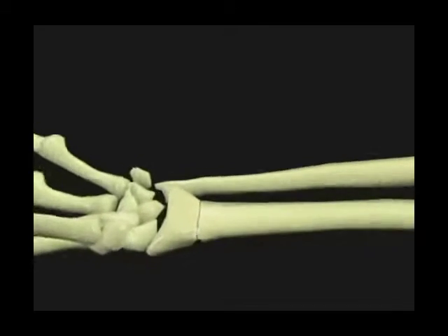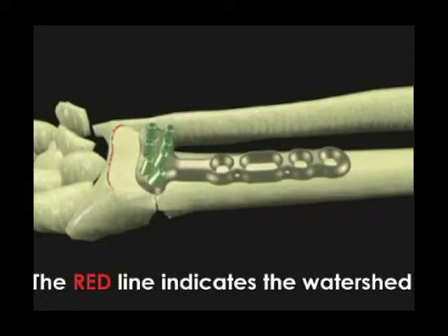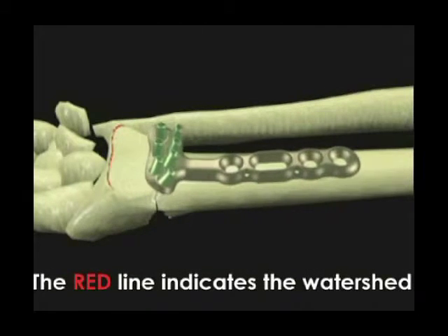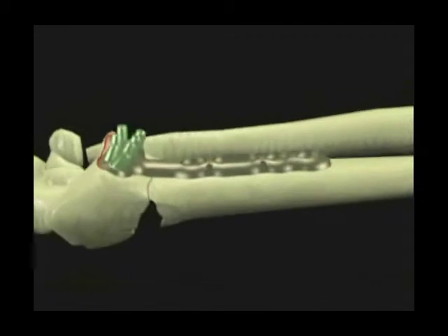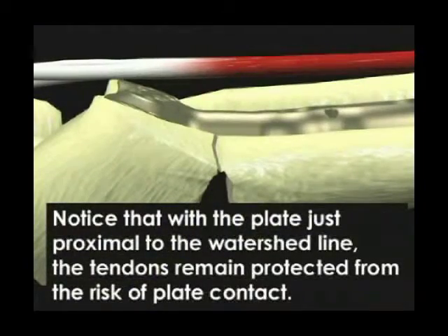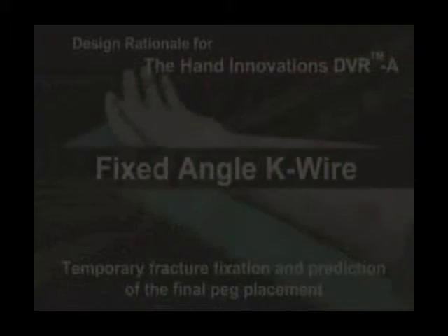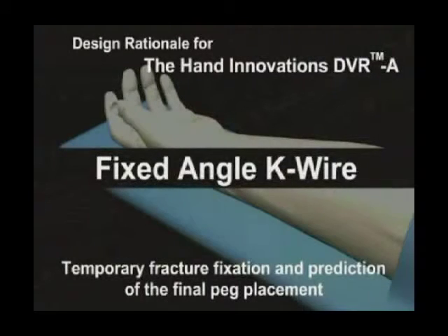To identify the watershed line, palpate the radius distally to identify the volar rim of the lunate fossa. Notice that with the plate just proximal to the watershed line, the tendons remain protected from the risk of plate contact. The DVR anatomic plates incorporate fixed angle K-wire holes for provisional plate positioning to aid in the reduction of the distal fragments and allow you to assess the correct peg placement prior to drilling.